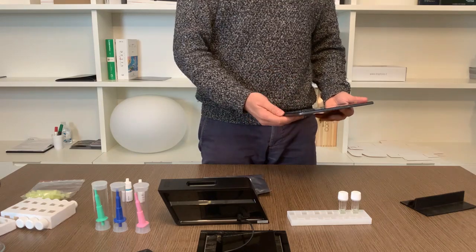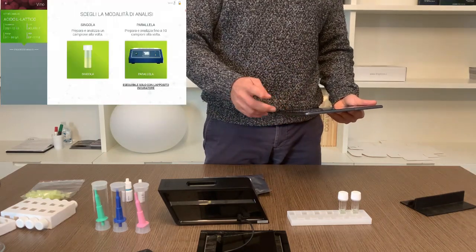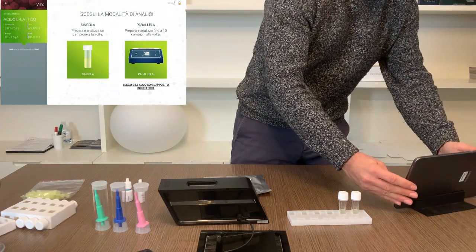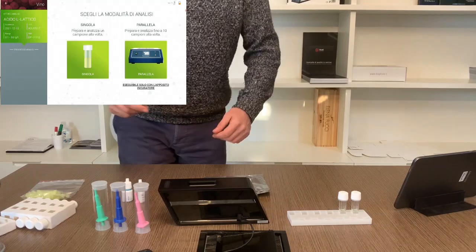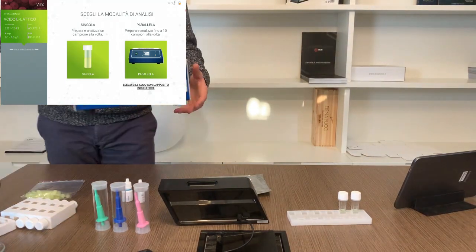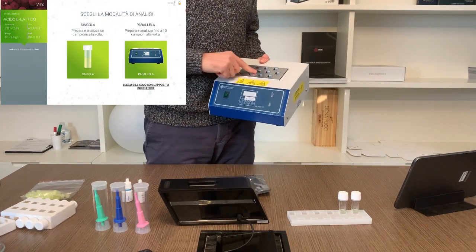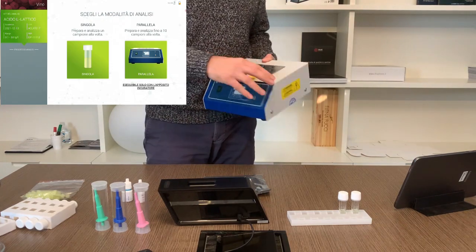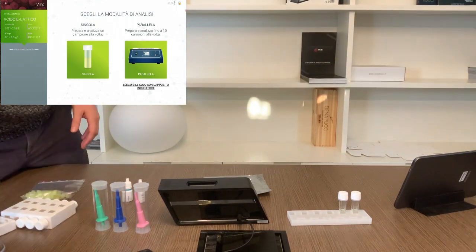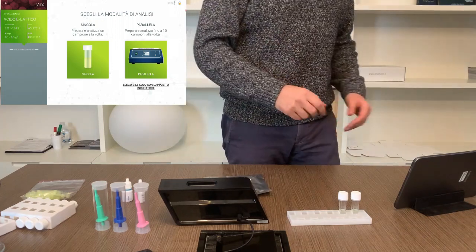When you get to the screen where the app asks whether you want single analysis or parallel analysis, you can choose to analyze one sample after another in sequence or to analyze ten samples at the same time. To do the analysis in parallel you need an additional accessory — an incubator that allows you to keep up to ten samples at a temperature of 37 degrees. In this case we choose single analysis and continue.